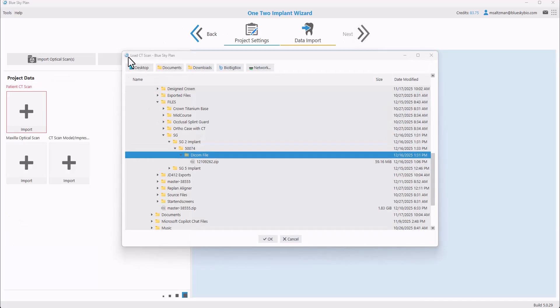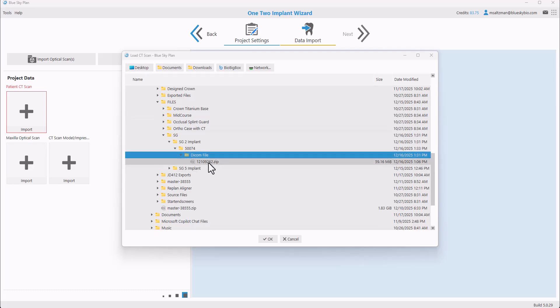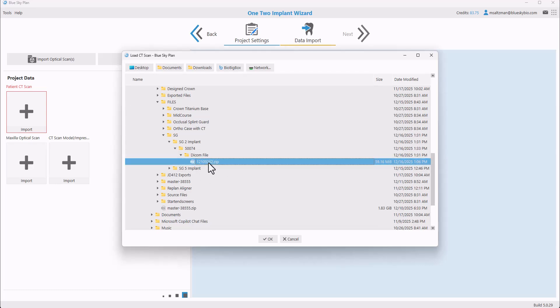Select the relevant jaw and then click the Next button to proceed. We're now being prompted to load the patient CT scan. Navigate to the location on your computer for the relevant scan. You could use the buttons in the horizontal toolbar for quick access. Our DICOM file for this case is a zipped file, which is totally fine. We'll select it and click the OK button.